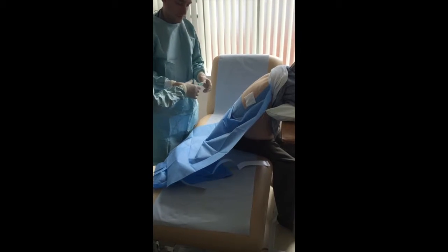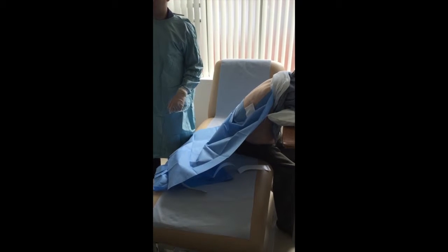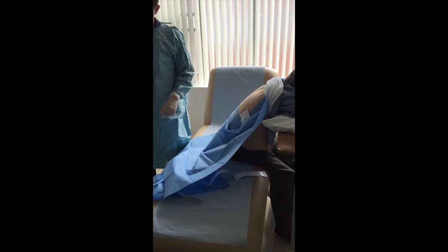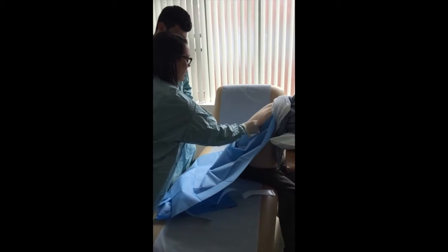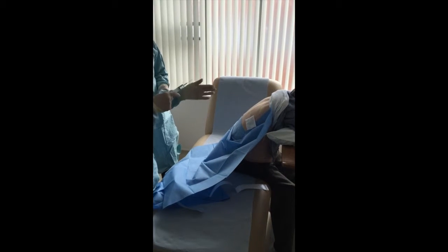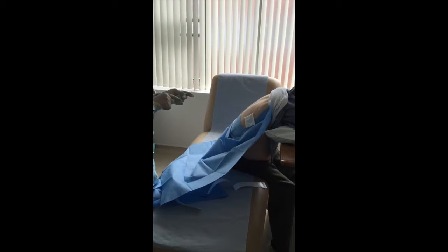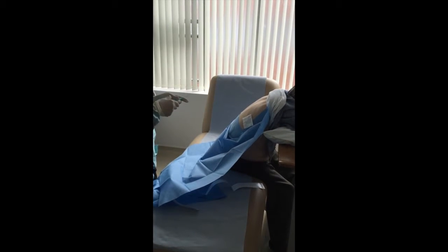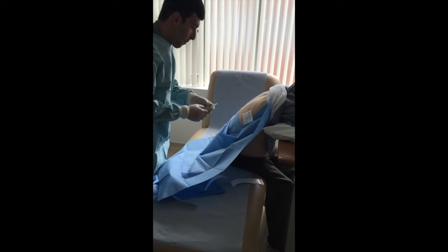And what we'll do is we'll change the needle over to a green needle because we're going to give deeper infiltration in a minute. And if you remember the scan we did, we saw that we were going to get fluid at about 2 to 3 centimetres depth. So you're going to be going in through the skin. You're going to go over the top of the rib to avoid the neurovascular bundle. You're going to be facing the opposite shoulder tip. And as you're going in, you're going to be aspirating and infiltrating until you get pleural fluid. So facing the opposite shoulder tip. So use that angle.